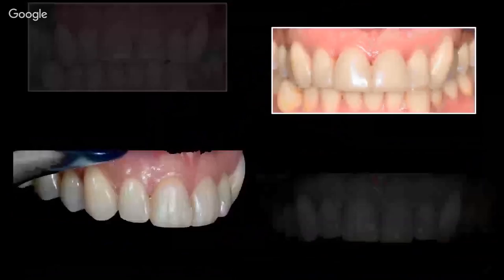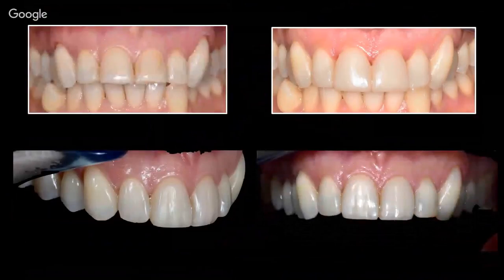So we can see the difference in the smile. The canines are still a little bit longer, but unfortunately, she refused to cut them a little bit, and I couldn't make the lateral and central incisors even longer, because they would have become not nice at all, not natural at all. So yeah, that's what we achieved. The beginning, the end of the first appointment, and finally.